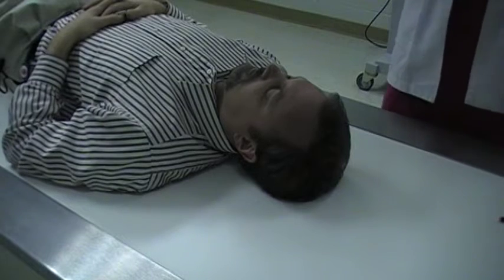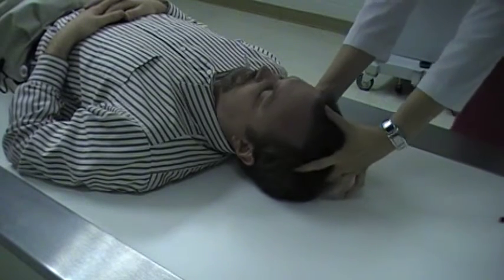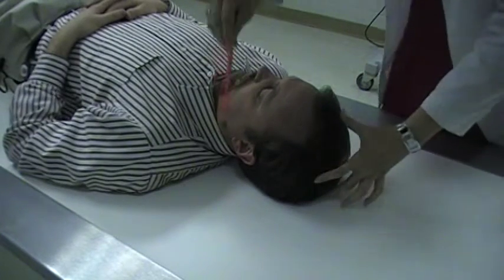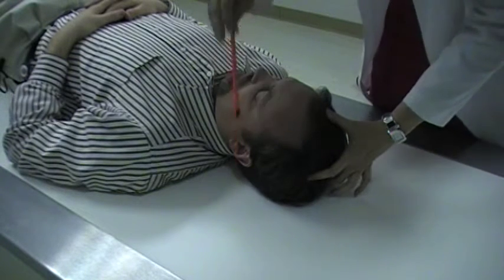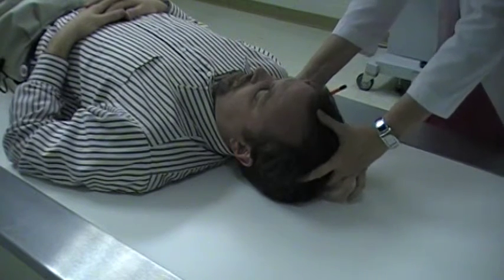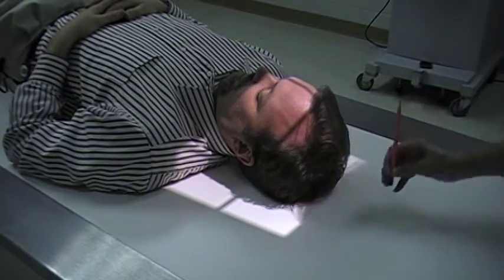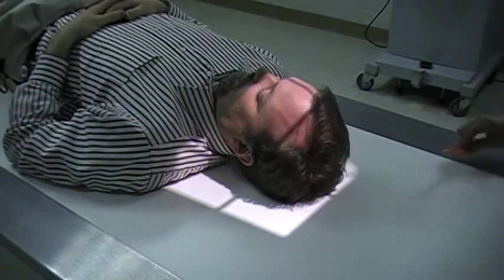Positioning for the cranium, I'm going to do the Towne method. You need to have your patient's chin ducked down because we're going for the orbital meatal line going perpendicular into the table. So make sure your patient holds that ducked chin. Double check, make sure that your mid-sagittal line is going vertical.